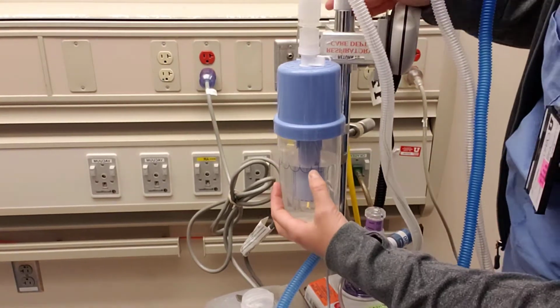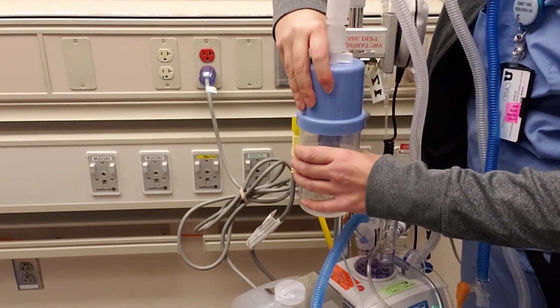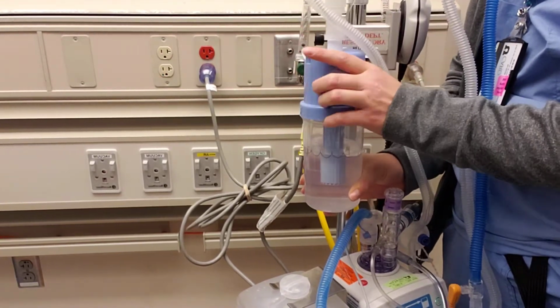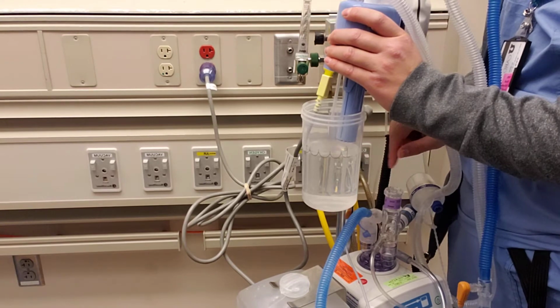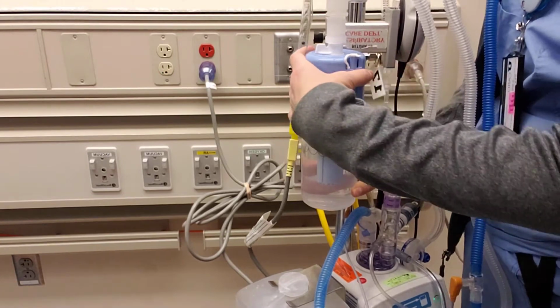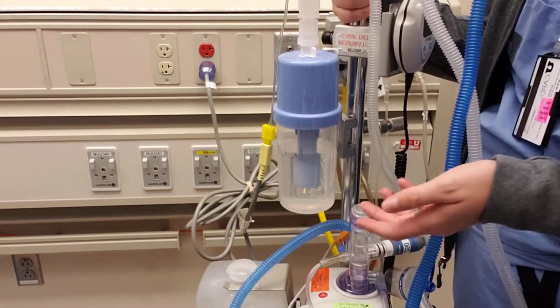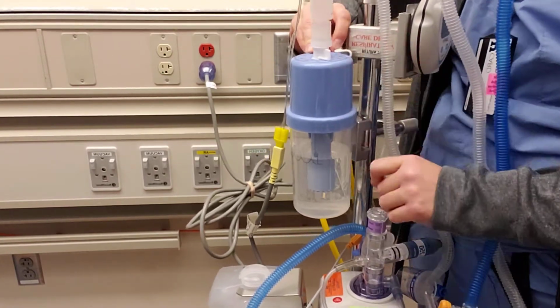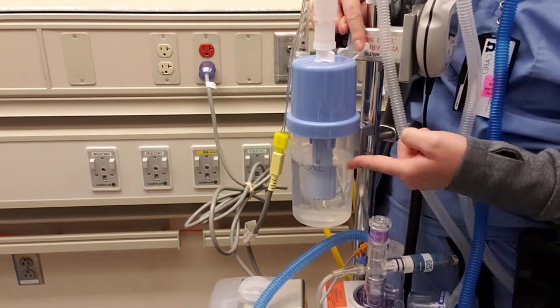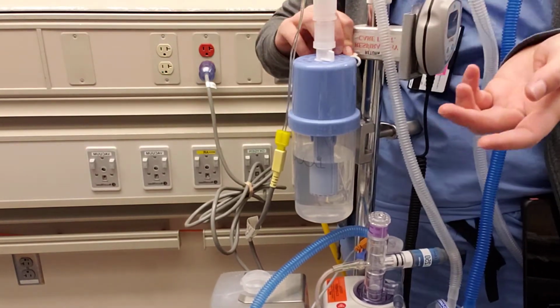If you guys can see it, there's a line right here. You will feel this twists off. And you fill this cup up to the marked line with water. Then you attach your CPAP and screw it on. If for some reason you overfill or there is excessive condensation building up in here, you do have this device that you can attach a syringe to that you pop open, and you can draw up water with the little white straw in there to get back to the level so you're giving adequate and appropriate pressures.